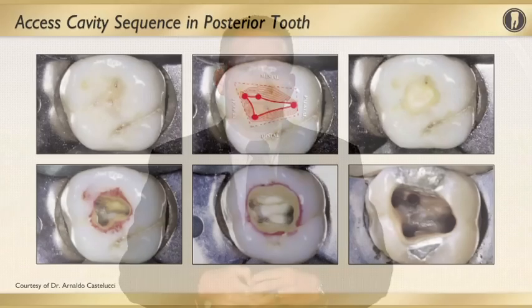endodontic cases. Failure to realize the presence of extra or aberrant canals is the most common way that we provide failure in the treatment of endodontic cases for our patients. So we must pay astute attention to detail in all that we do to identify all the canal anatomy. And again, this is overcome through proper and adequate canal preparation, or posterior access preparation.